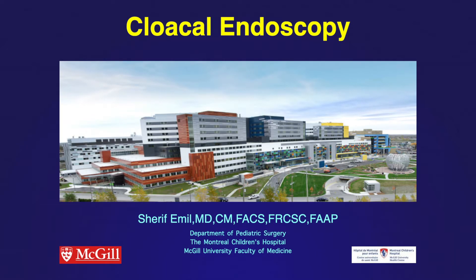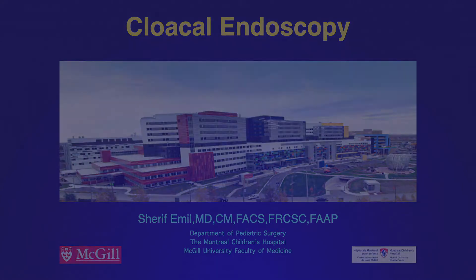Persistent cloaca is one of the most complex anorectal anomalies. In this condition, the length of the common channel is directly related to the complexity of the reconstruction. Cloacal endoscopy is therefore a very important component of the workup of these patients. The endoscopy is performed using a pediatric cystoscope. This video demonstrates examples of short and long common channels identified on endoscopy.